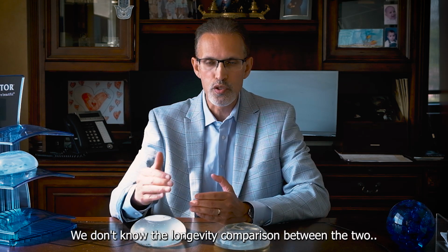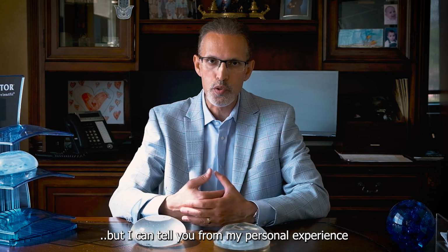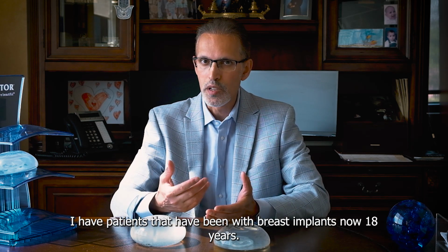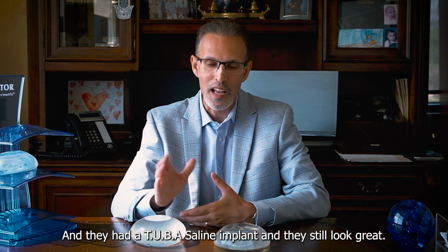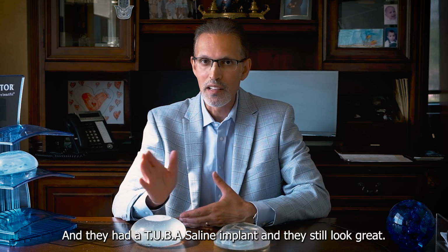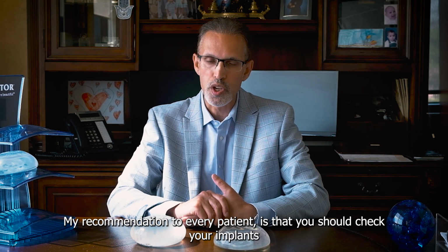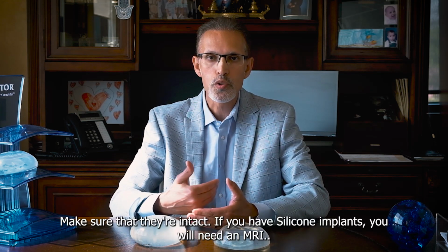We don't know the longevity comparison between the two, but I can tell you from my personal experience, I have patients that have had breast implants now 18 years, 19 years, 17 years, and they had a saline implant and they still look great. My recommendation to every patient is that you should check your implants every 5 to 10 years with your surgeon. Make sure that they're intact.